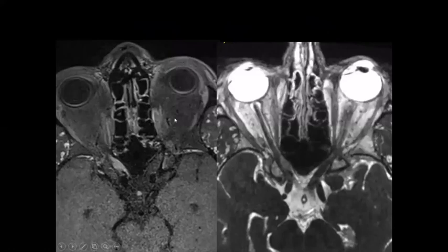As I said, on the outside institution study, we repeated the imaging using a high-resolution technique, and you can now appreciate in the axial plane that we have here some pathologic enhancement, and in fact there are dural tails along the anterior and posterior aspect of that mass in the optic canal. And in the axial plane on post-contrast CISS images, I hope you can appreciate that this is in fact the optic nerve. And this mass does not involve the optic nerve.